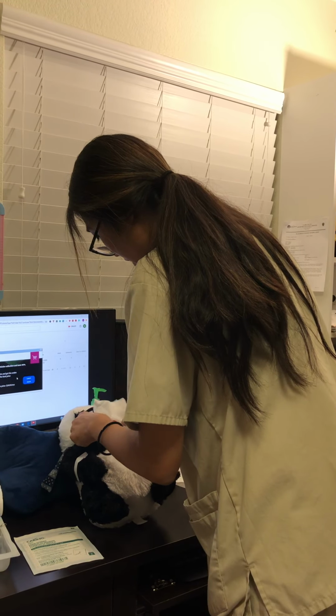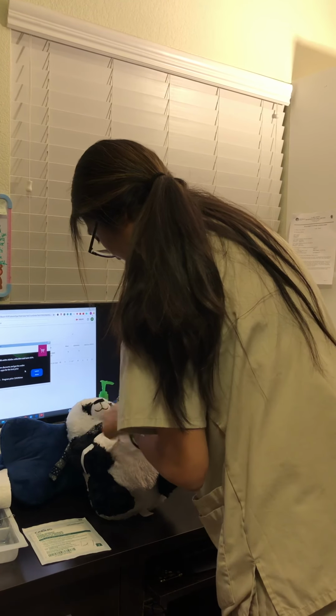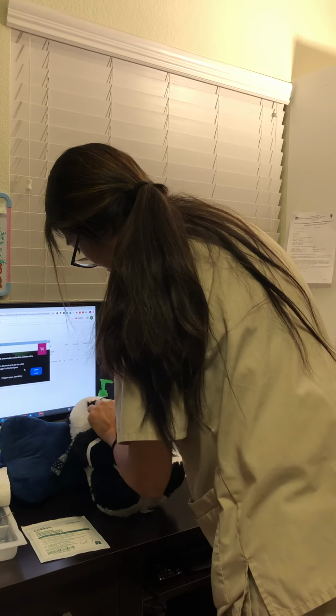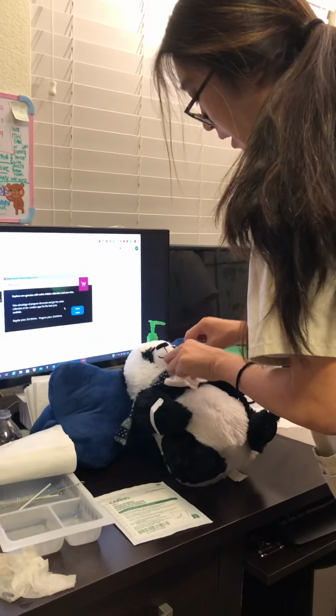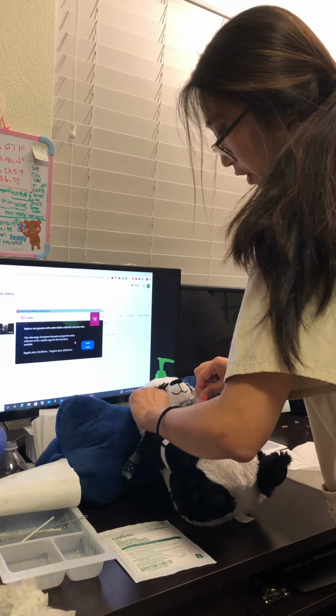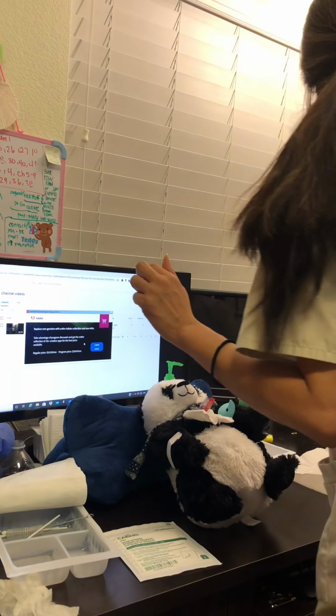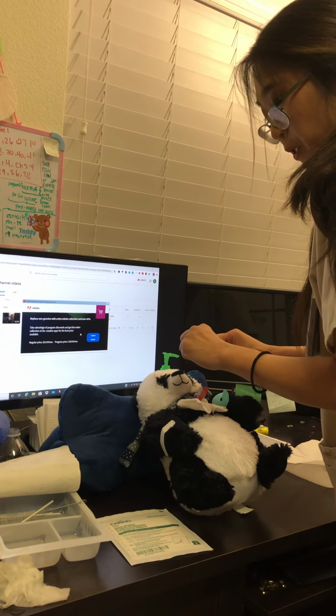And then you would make sure that it goes over, and then it would go under the tie. But then make sure everything is secure. This tie is still on there, so if you have a new tie, keep that tie so it stays secure.